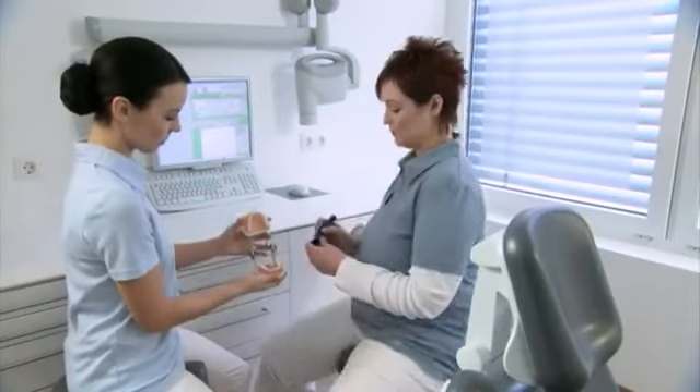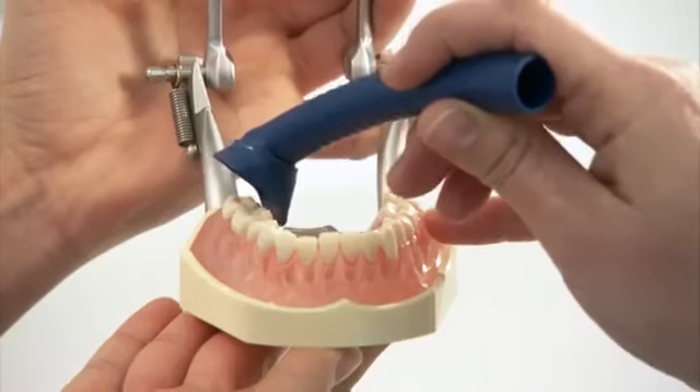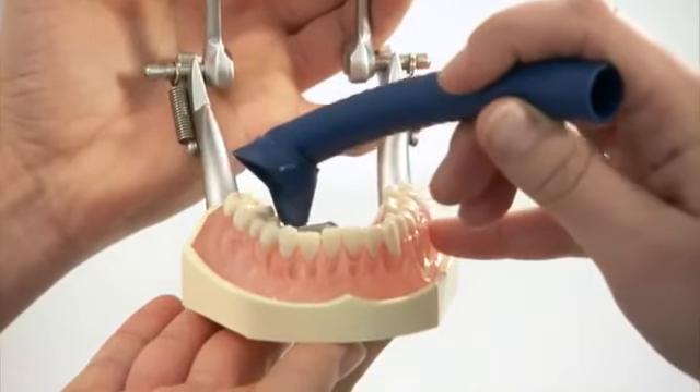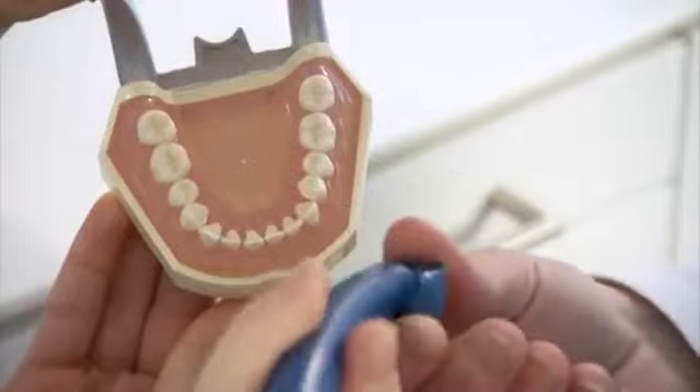Using the prophylaxis cannula on dental models shows the exact arrangement of the cannula and the protective shield in all treatment positions. The distinct side of the rotating protective shield is always towards the gingiva during aspiration.